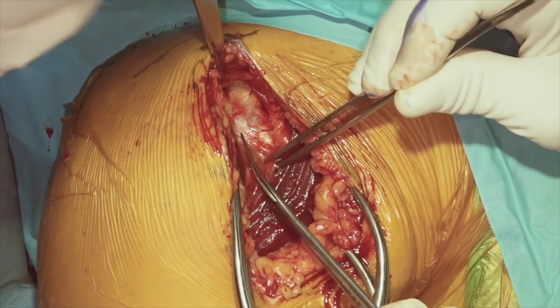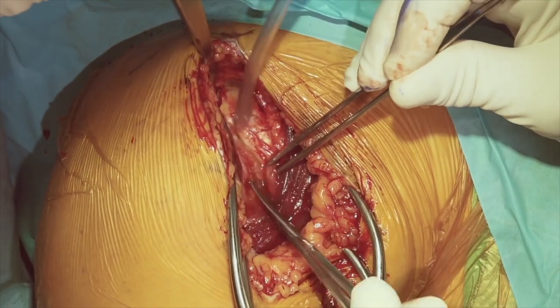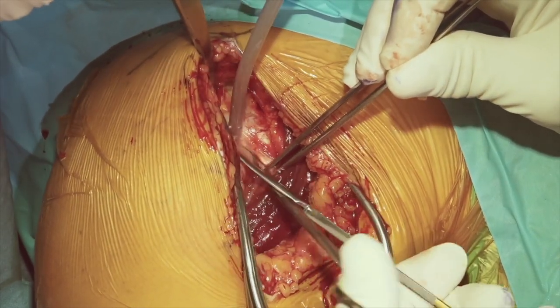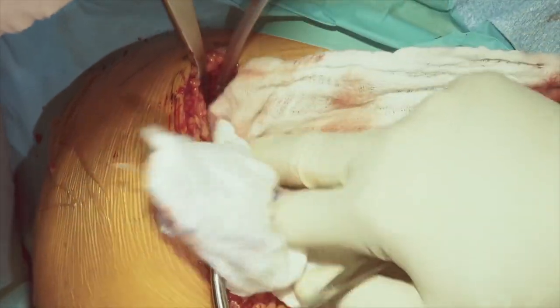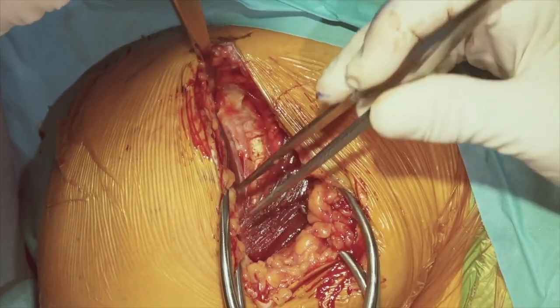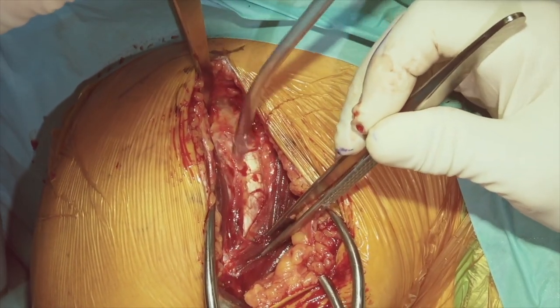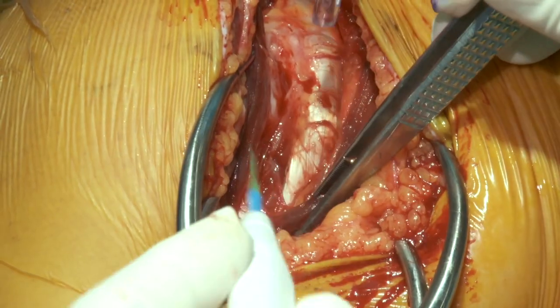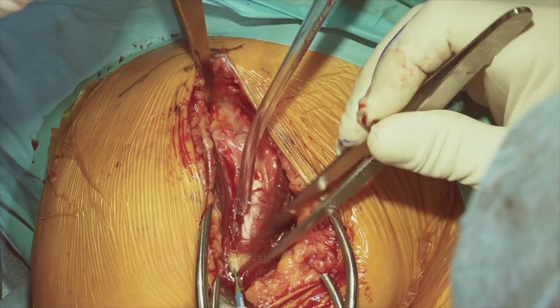In this layer we would expect to get some joint fluid, which we do right away because of the failure of our subscapularis — which we can be highly suspicious of based on our preoperative radiographs and can confirm from our preoperative MRI. Typically what we'd like to do is release approximately a centimeter to a centimeter and a half of the pectoralis major tendon inferiorly.